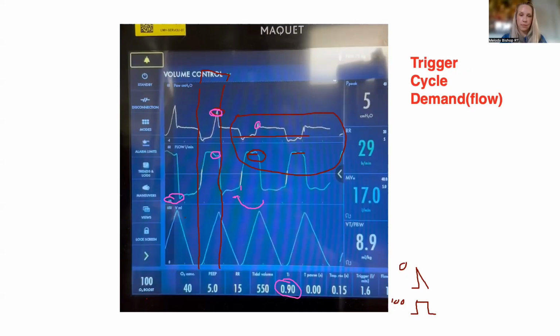So these high minute ventilations really get me nervous, because if I don't have a good reason for it, or even if I have a reason for it, let me take a step back. What I mean is, let's say this was the worst kind of person to put on the vent, like a patient with DKA, right?